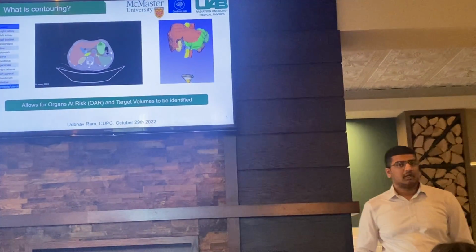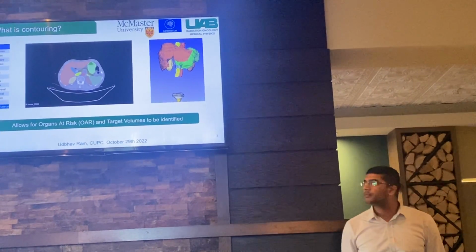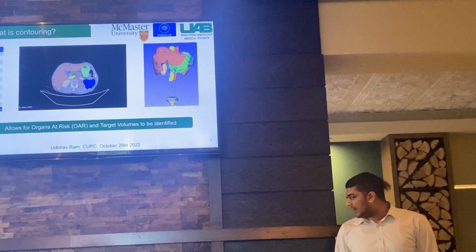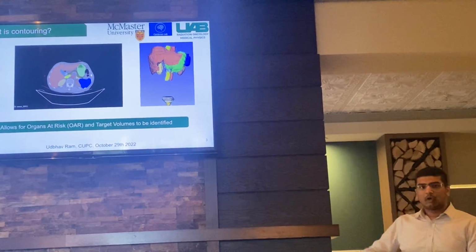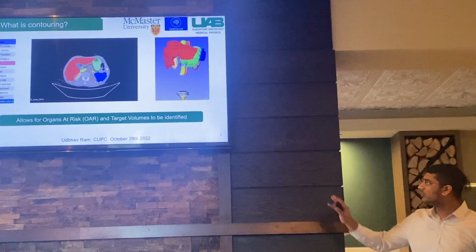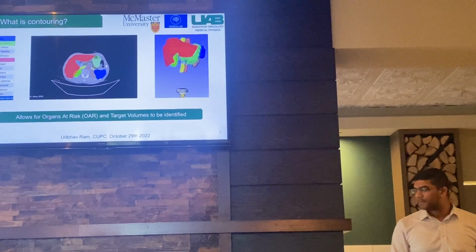For example, we can see in our list that an organ that we are interested in is a spleen. We can see it here on the 2D image, segmented. And finally, we can see stacked across all of these different slices of the CT image, the 3D version. We can do the same for any number of organs, in this case the liver and the right kidney.